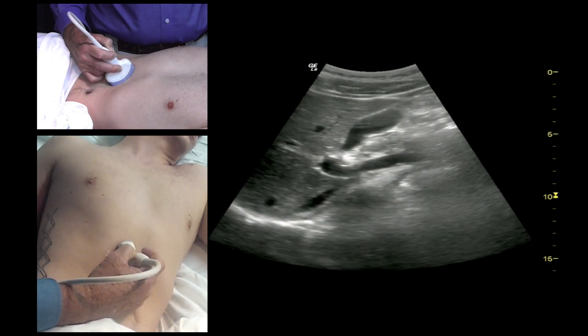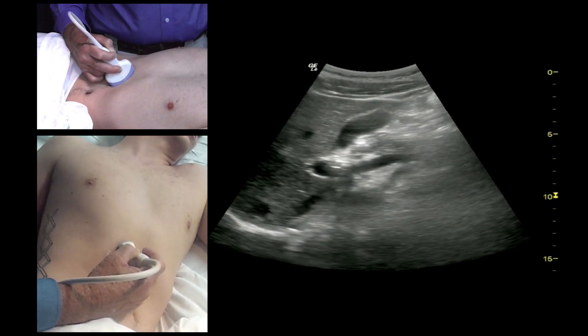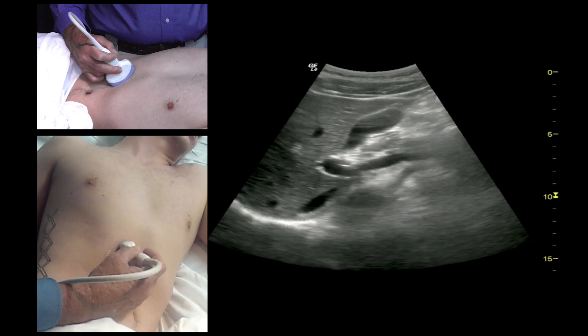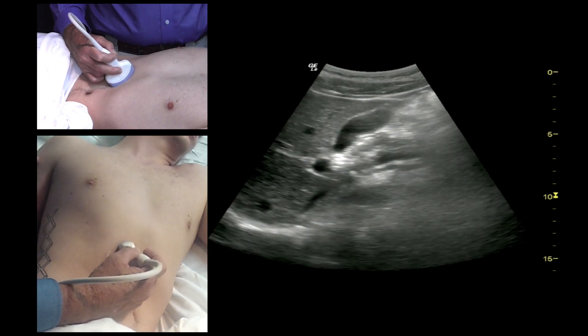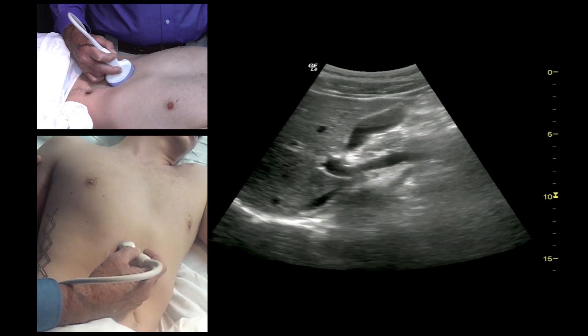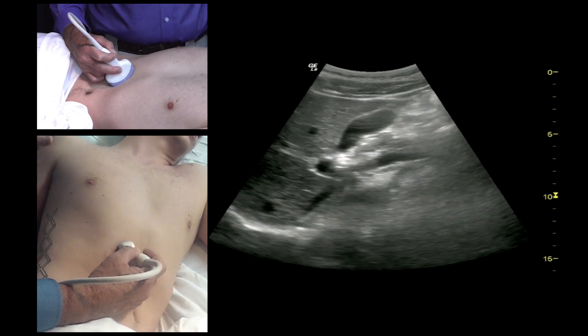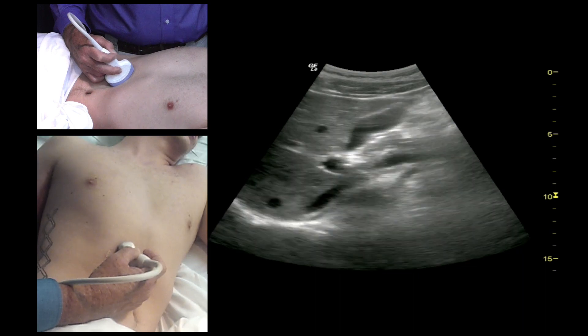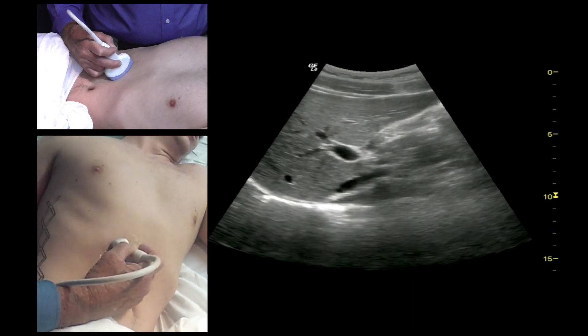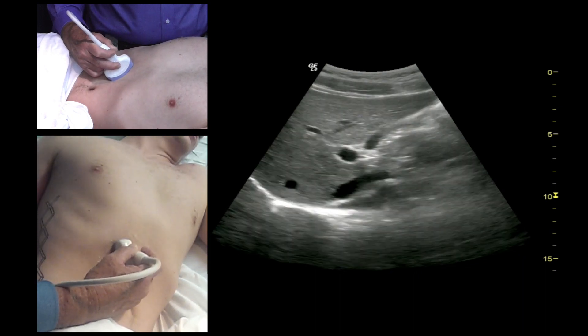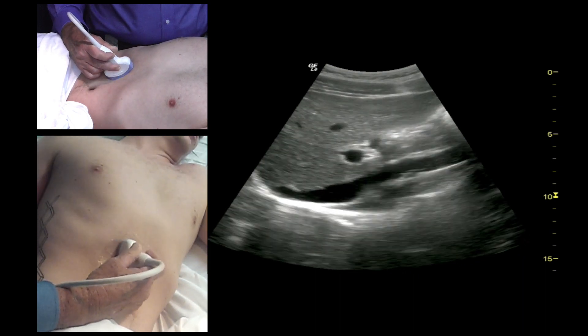If you're having trouble imaging the gallbladder, you can have the patient roll into a left lateral decubitus position, or you can have him take a deep breath and hold it, which pushes the gallbladder down toward the probe.